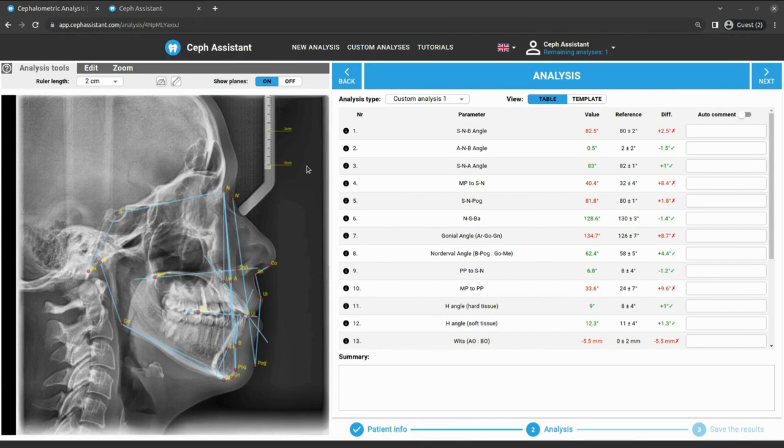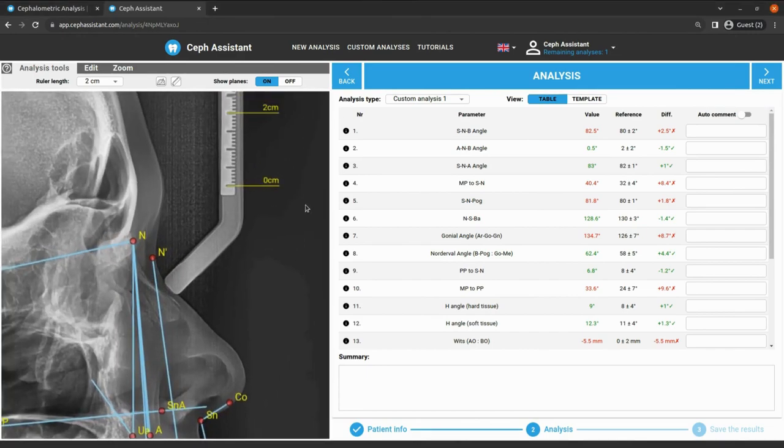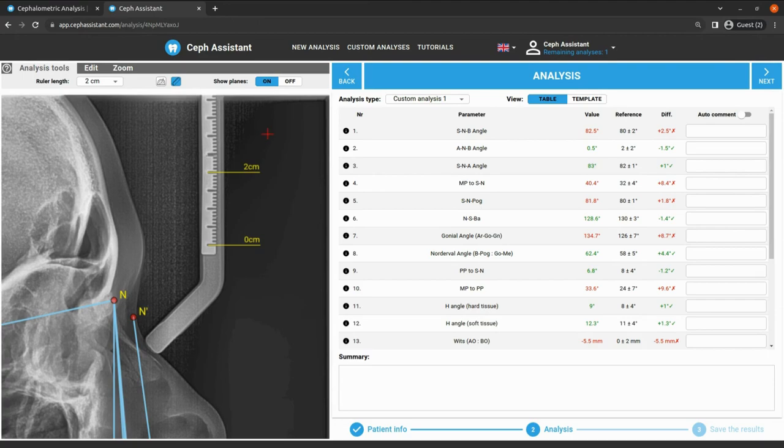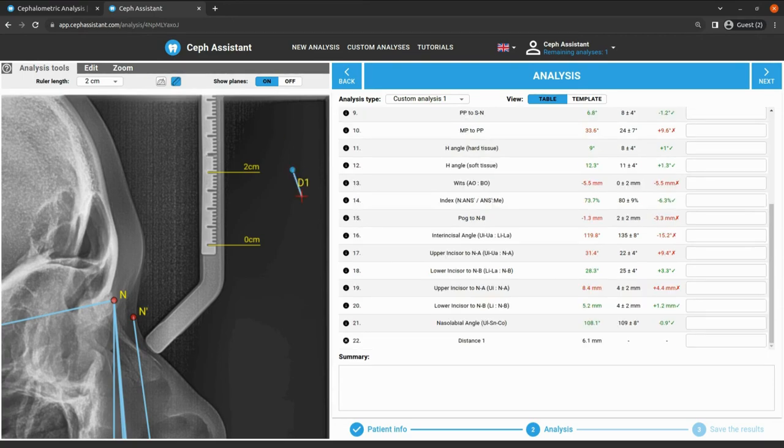To measure a distance manually, please click on the button in the analysis tools. Move the cursor to the image and place the first and then the second reference point.